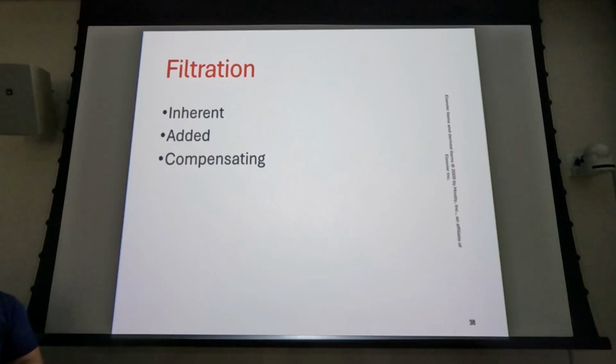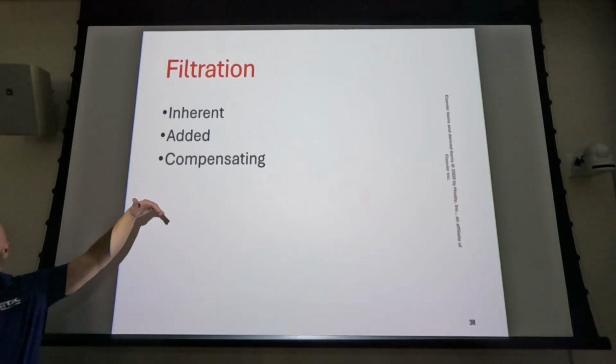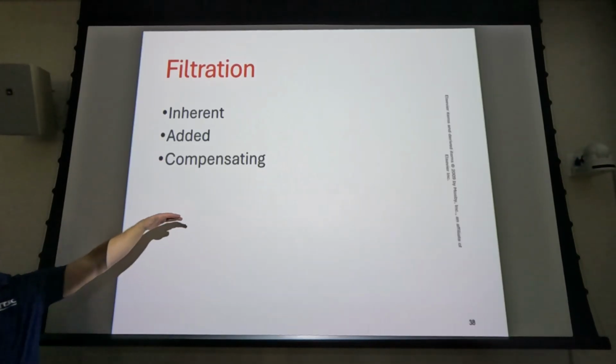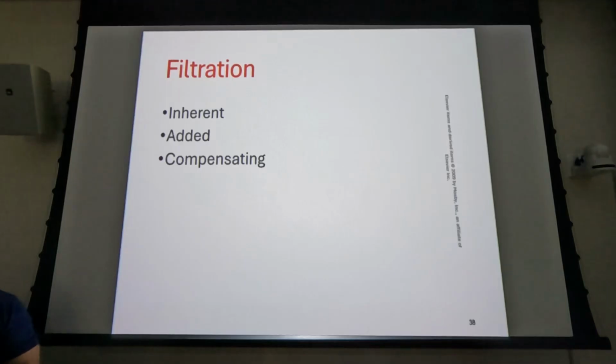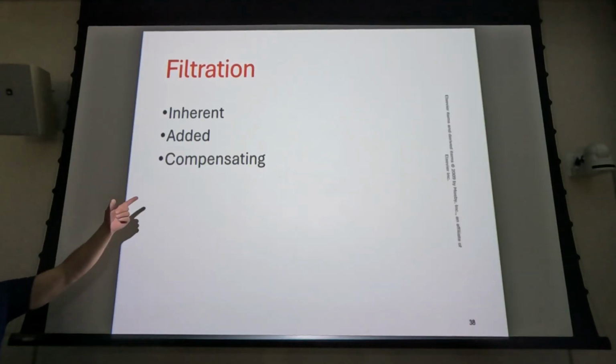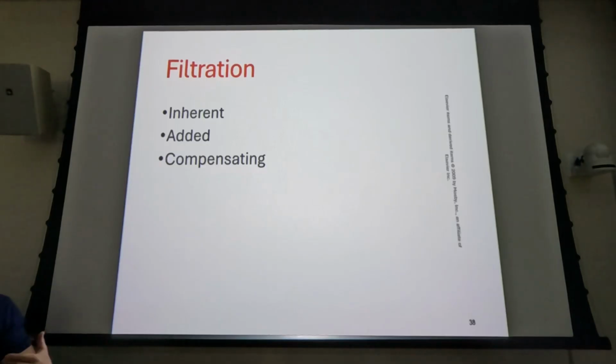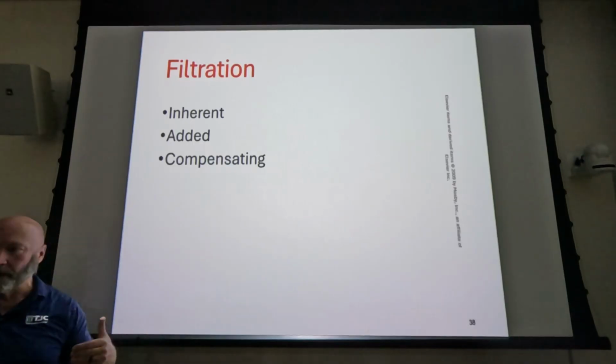So has anybody ever seen a wedge filter in a hospital? Probably not. The only place you might see one now would be if you do a rotation through a clinic that does scoliosis series. A scoliosis series will use, and it's not really a compensating filter as much as added filtration, and not really even added filtration, but more efficient collimation essentially. What they'll use is what we refer to as a trough filter, and a trough filter is kind of like a double wedge.